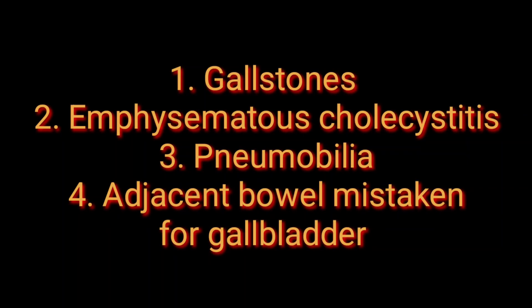As far as the differentials for porcelain gallbladder are concerned: at the top you may think of gallstones causing acoustic shadowing; you may think of emphysematous cholecystitis, but take the patient history — there will be a history of pain and other symptoms; you may think of pneumobilia, but there will be a history of previous surgery or intervention; and you may also be mistaken, thinking an adjacent bowel loop is the gallbladder.